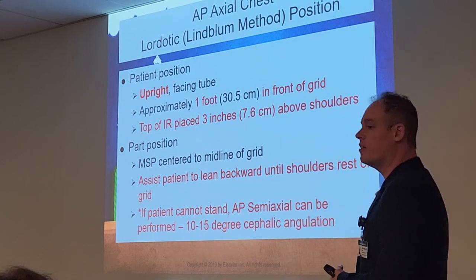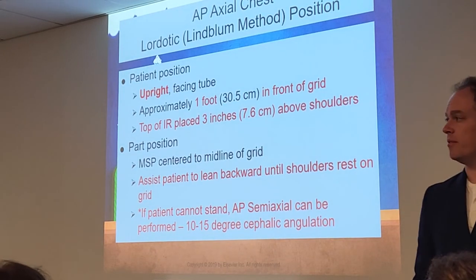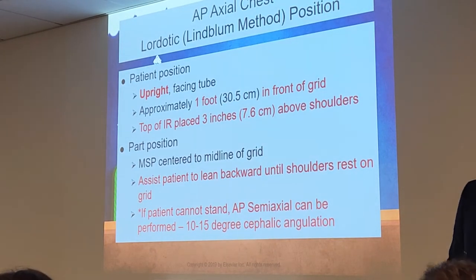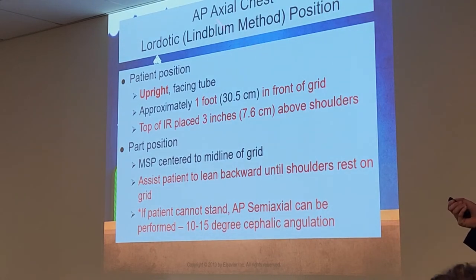All right, so here's that other AP, guys, our AP axial chests. Now, when you see the word axial, once again, it means we have some angulation going on, but one thing to keep in mind is we're actually not angling the tube, we're angling the patient. We're putting them in a lordotic position. Write this down, I'm not sure it's in your book, but there's also an alternative name, it's called the Lindblom method. Lindblom method, I've seen them use that in questions. Lordotic position, Lindblom method.